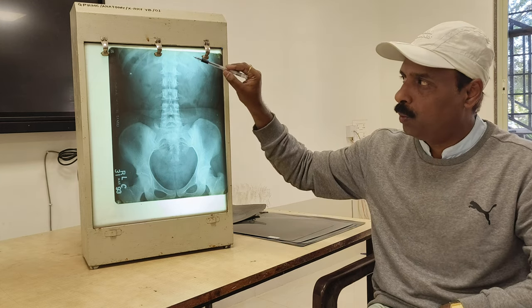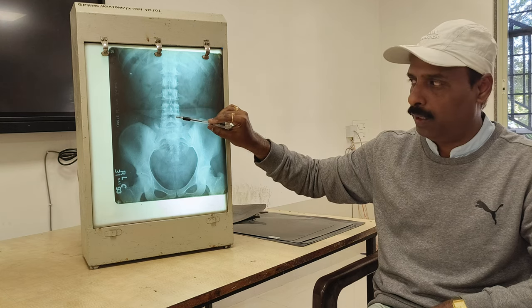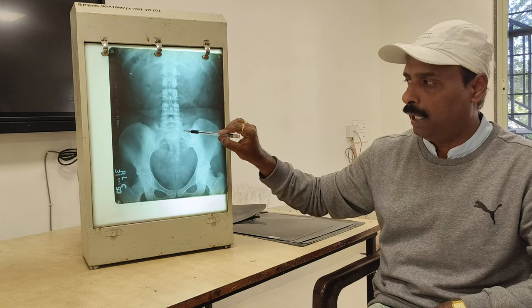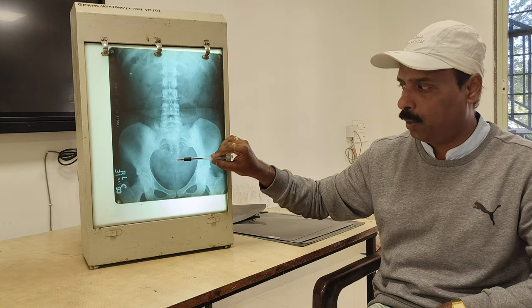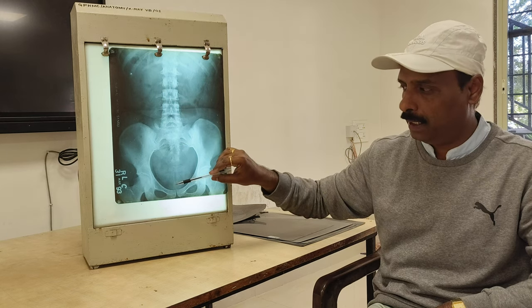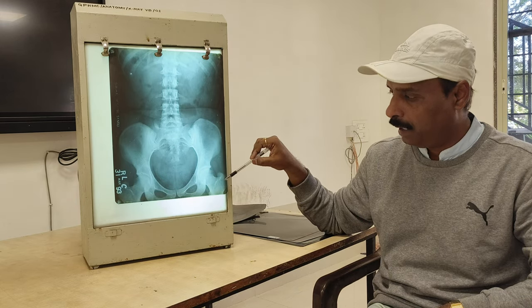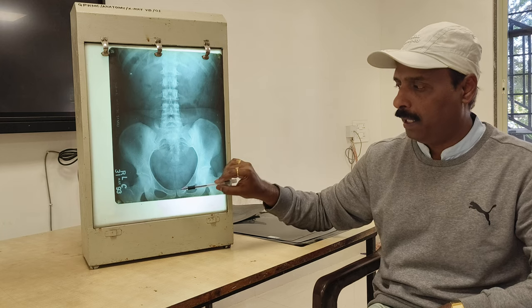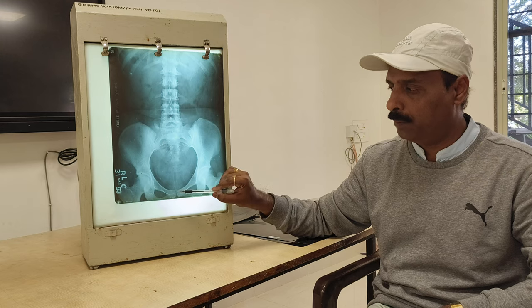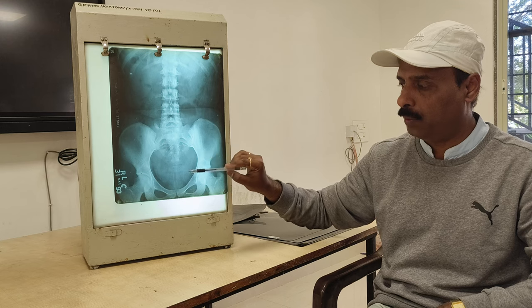So you have to identify this as the plain x-ray of KUB, kidney, ureter and urinary bladder. What you can see is the lower part of the ribs, and the vertebral column, the lumbar vertebrae. On both sides you have the hip bones, and you have the sacrum and coccyx in the pelvic region. This is the pelvic inlet. On both sides you can see the head of femur, greater trochanter, lesser trochanter, and pubic symphysis and obturator foramen.